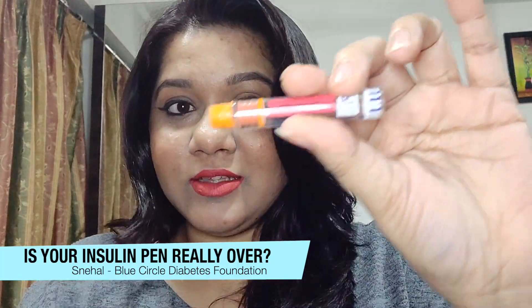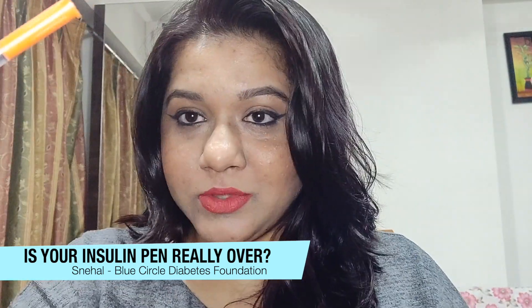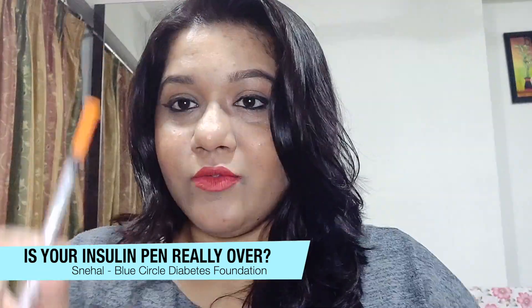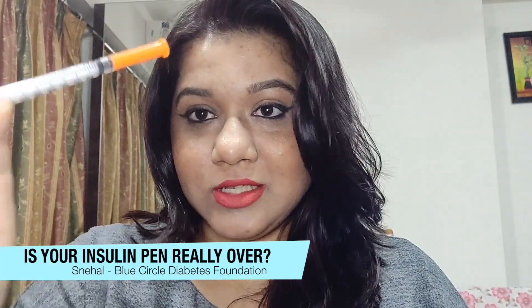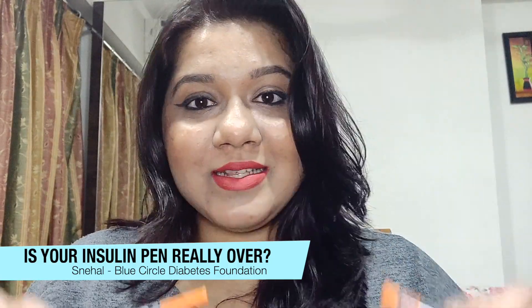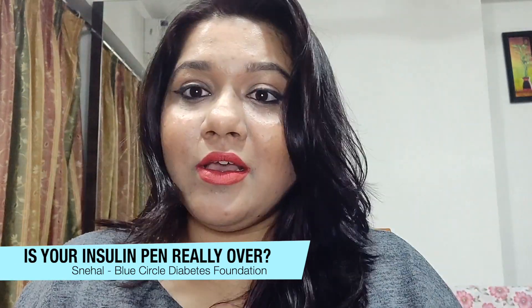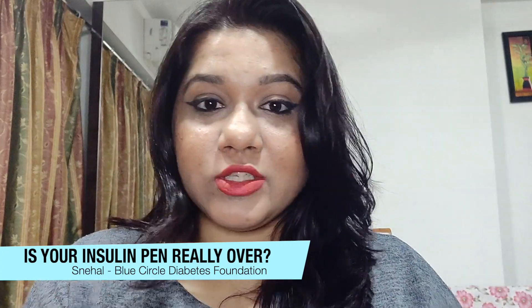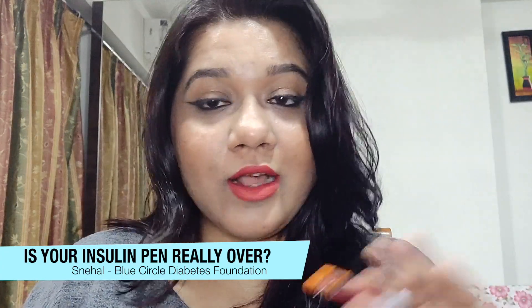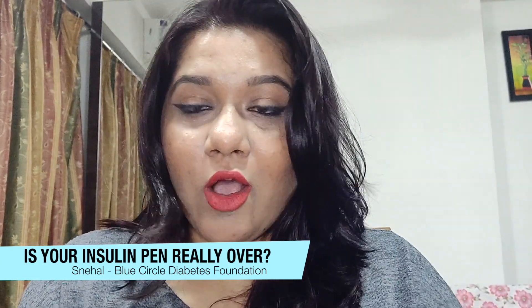What we are going to do is take this insulin out using a 100 IU syringe, which is the orange-capped syringe. Since the cartridge is 100 IU insulin, we use a 100 IU syringe. Before we start, ensure that you have a cushion beneath you or you're sitting on a bed, so that if you drop the cartridge it doesn't break. Trust me, it hurts the most when you break a cartridge.